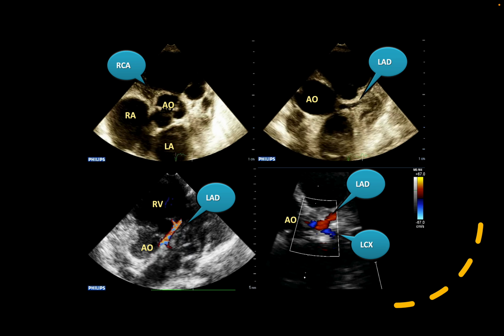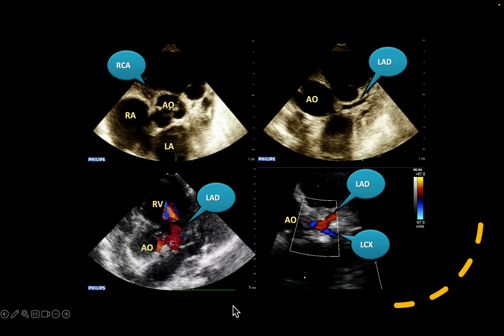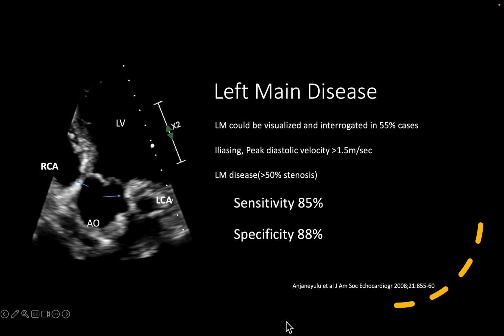And if you see, this is the left coronary artery which goes across, that's the pulmonary valve which goes across the right RVOT and also across the pulmonary artery. So then this is the aorta. You can see the LAD in color, on a color Doppler of the aorta, this is a patient with a short left main. You see a left main, you see LAD, the flow coming towards the transducer represented as red flow, and away from the transducer represented as blue flow in the circumflex. So left main bifurcates into LAD and the circumflex, and you can see both.